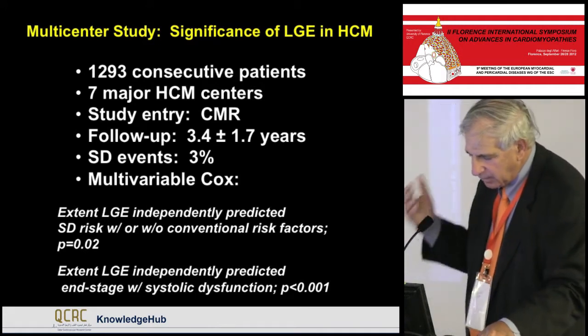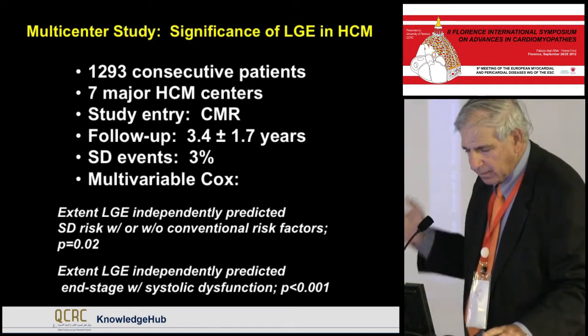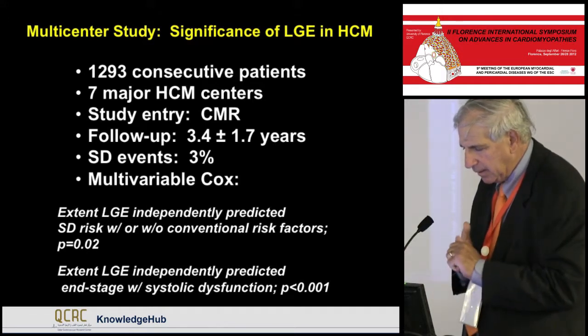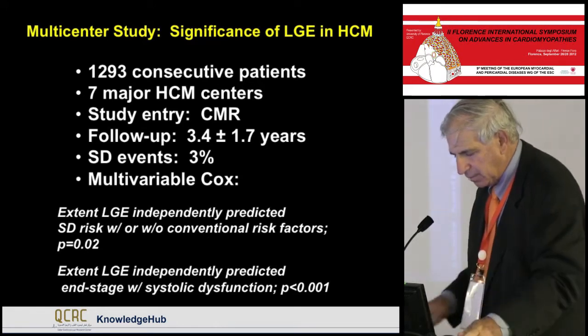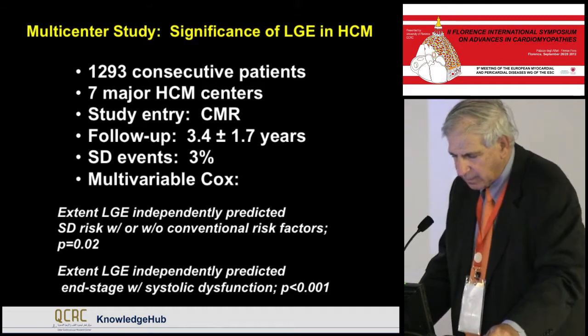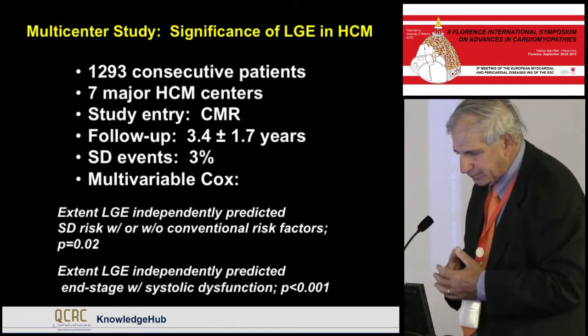And we have these data. The data I'm showing you now are not published. It's under review, but not published. And it is unique because we're talking about almost 1,300 patients at 7 major HCM centers that combined to create this database.